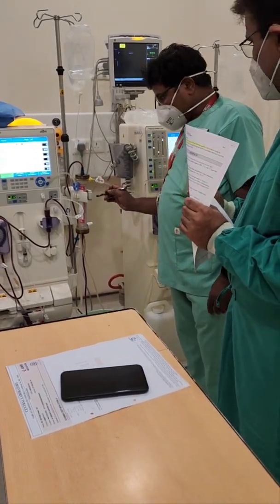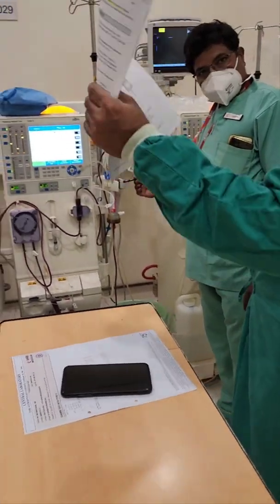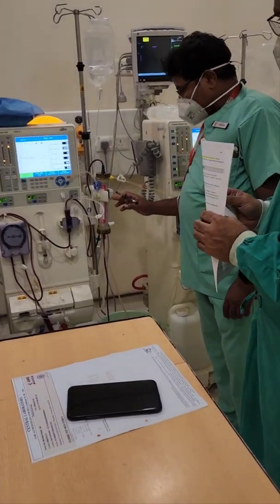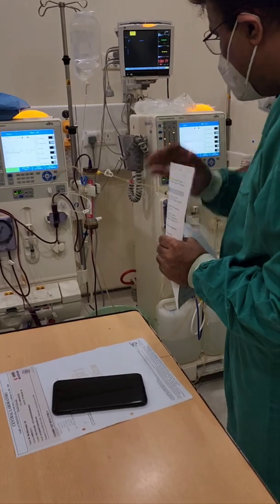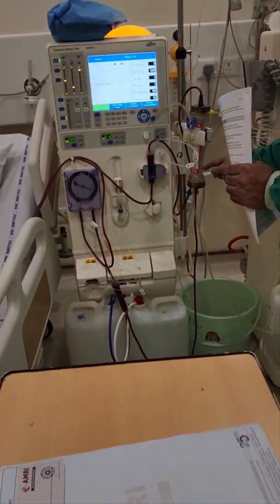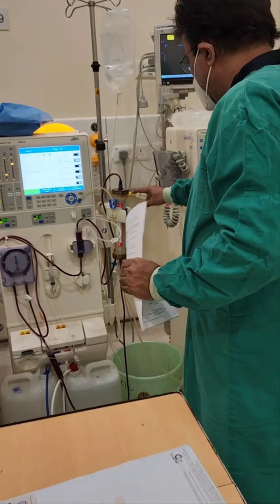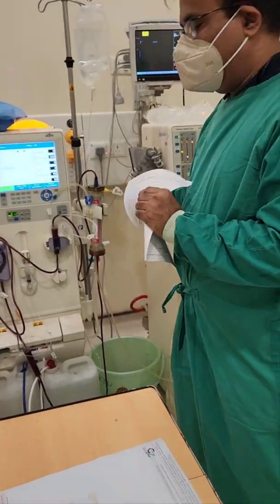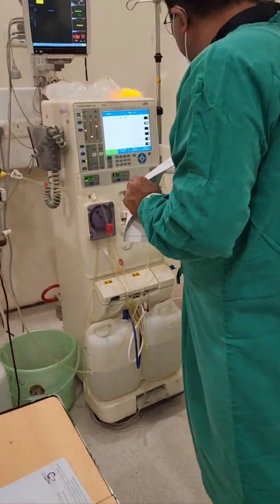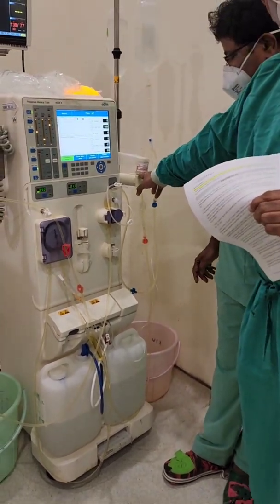There are two ways we can do it: either the centrifugal method, for which the blood bank can assist, or with the use of a plasma filter. We are essentially removing plasma. What happens is that when the patient's blood enters the plasma filter, the plasma is separated out and is not discarded — it comes through another tube. And here, the plasma arrives at this column — this is the champion of today's entire process, the glycosorb column.